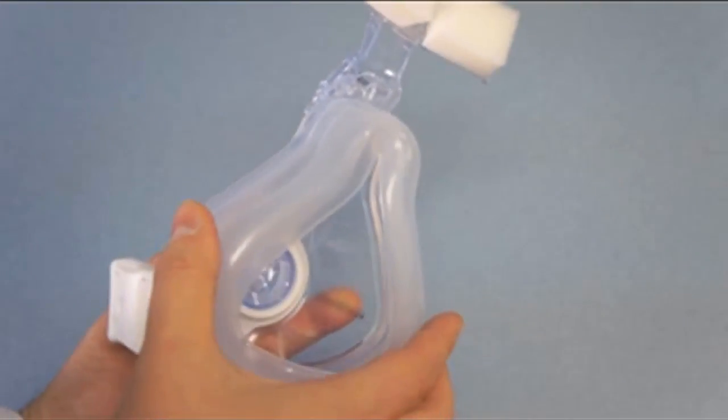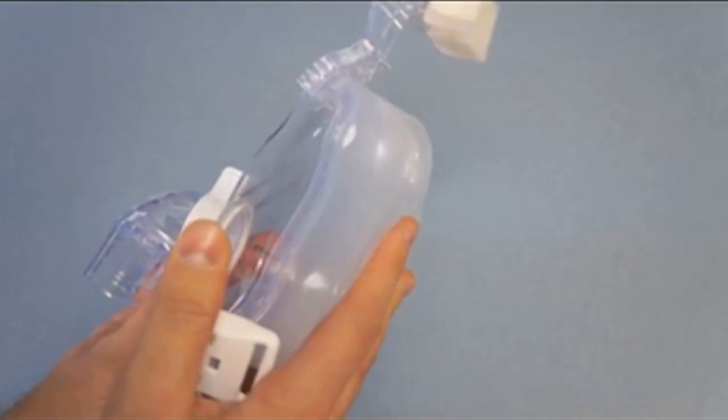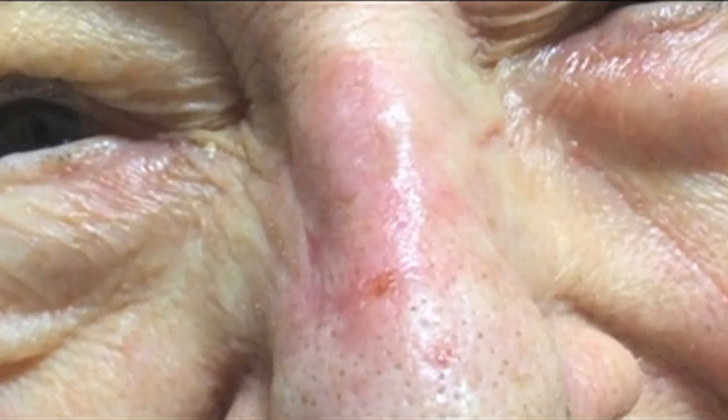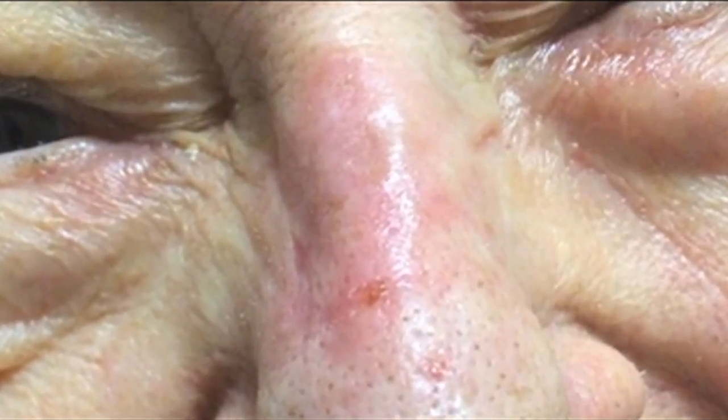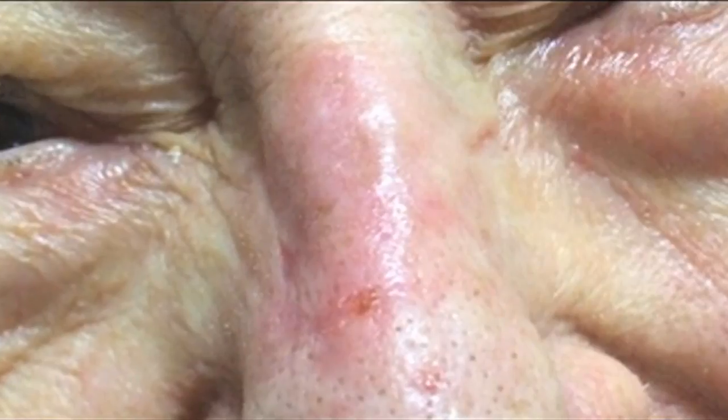This mask has a silicone cushion that forms a seal around the nose and mouth. If applied too tightly, however, this mask can be uncomfortable and abrade the skin on the bridge of the nose.